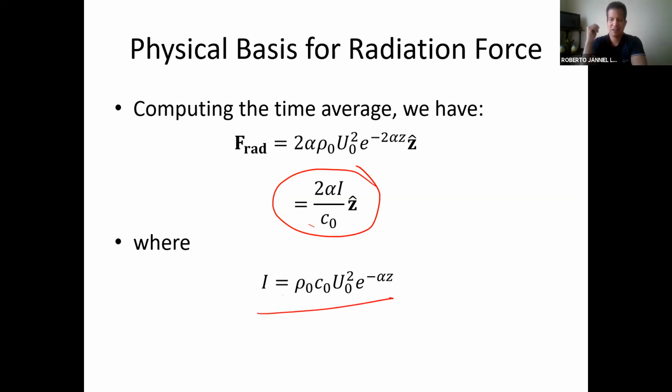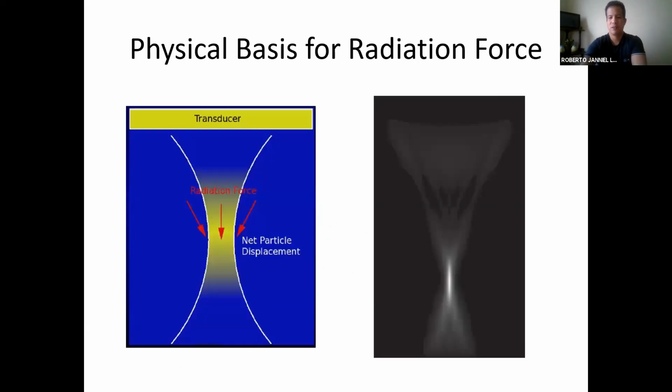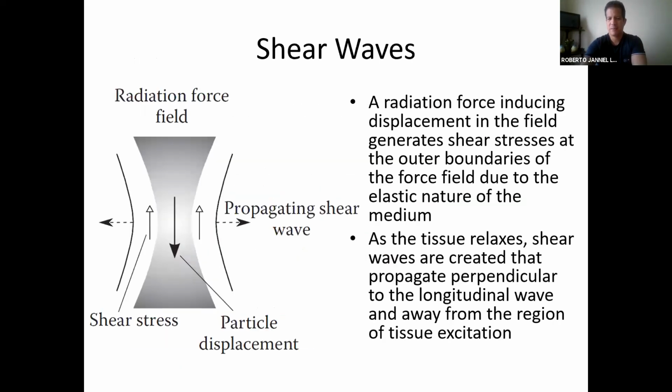So you can target or design ultrasound pulses that are of higher intensity than you commonly would use for imaging, and you use those to generate a push. Of course, it's a micrometer-scale push in the tissues that you're then going to dynamically track with an ultrasound imaging system, right? That's basically what you do.